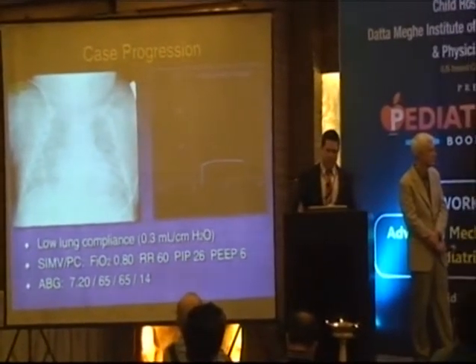So what will we do next? Should we continue ventilation and observe closely, perform an alveolar recruitment maneuver and hold the pressure for 30 seconds, give a second dose of surfactant, increase the inspiratory time to 1, or reduce the set respiratory rate? How many of you say C? Okay. What do you think? Those of you that didn't raise your hand, what do you think the answer should be? What's that? Observe ventilation, or just look at ventilation?